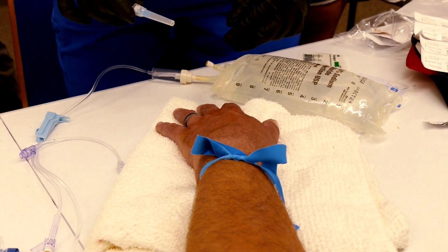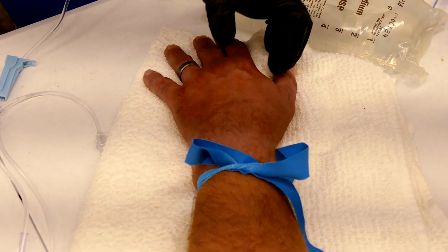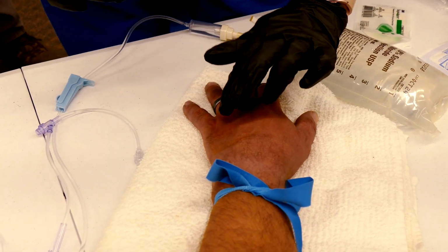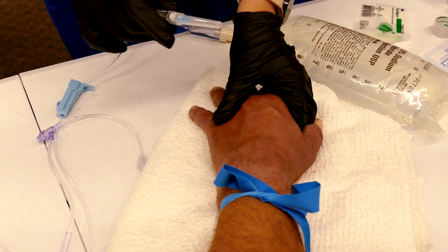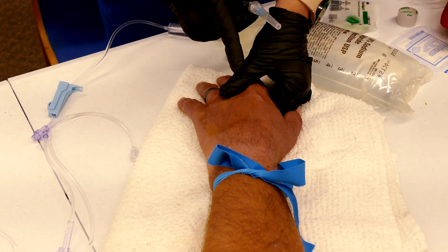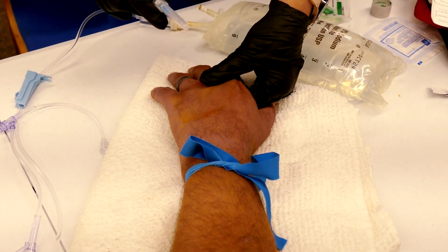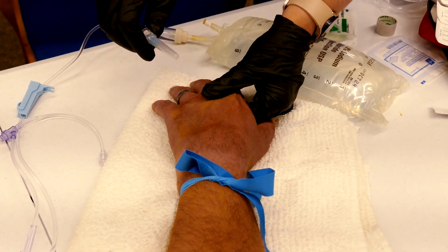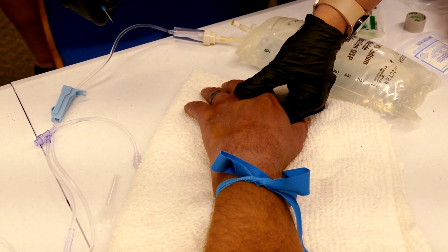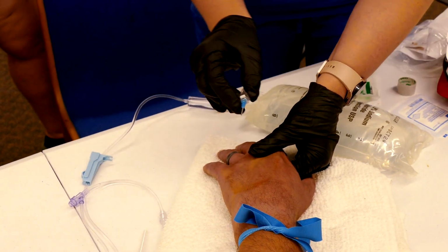So I'm very comfortable. Now typically what I do is my non-dominant hand to clean, to feel around. Same situation. Just make sure your left thumb is far enough downrange, but still able to do it, that you're not going to contaminate your needle. Okay, so I'm going to take this off now. Doesn't take much. Just a little.